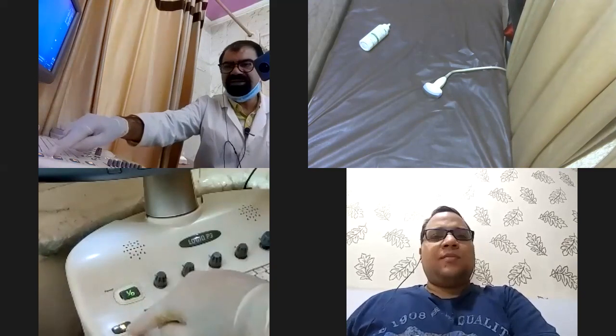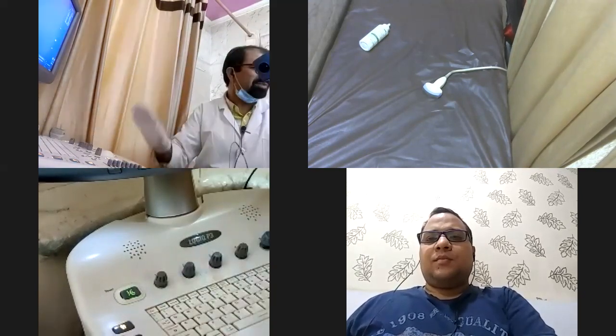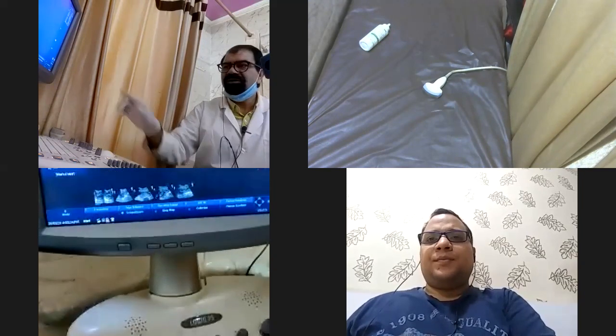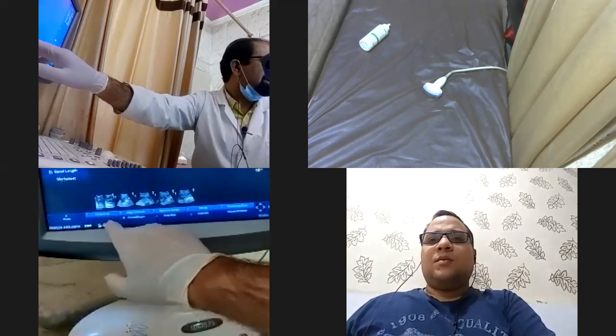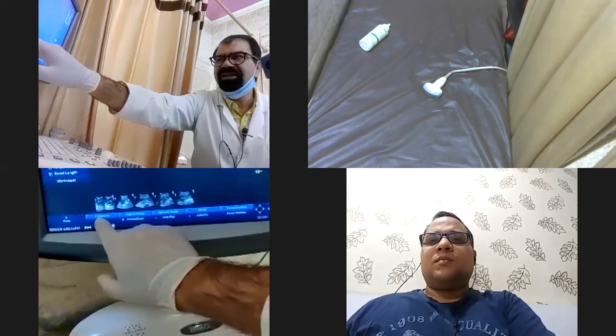Then there is a new patient, so I have to press the new patient button. This was already discussed with you in great detail in your class video, right? Now, the first thing that will appear is the frequency over here. This may not be very visible on the screen, but I can read it out and you can see on your machine that there is a frequency.